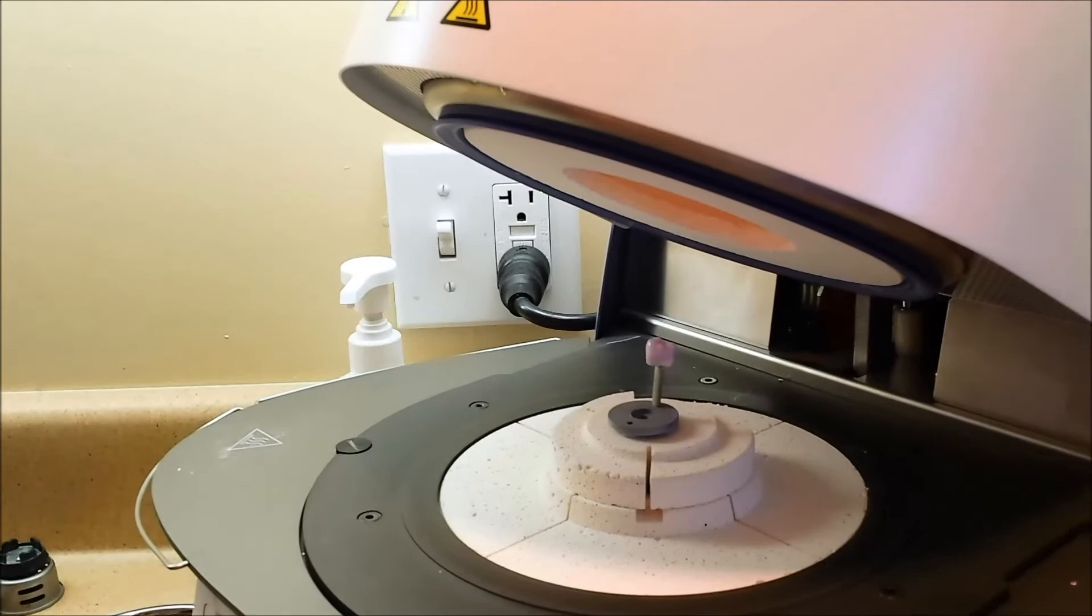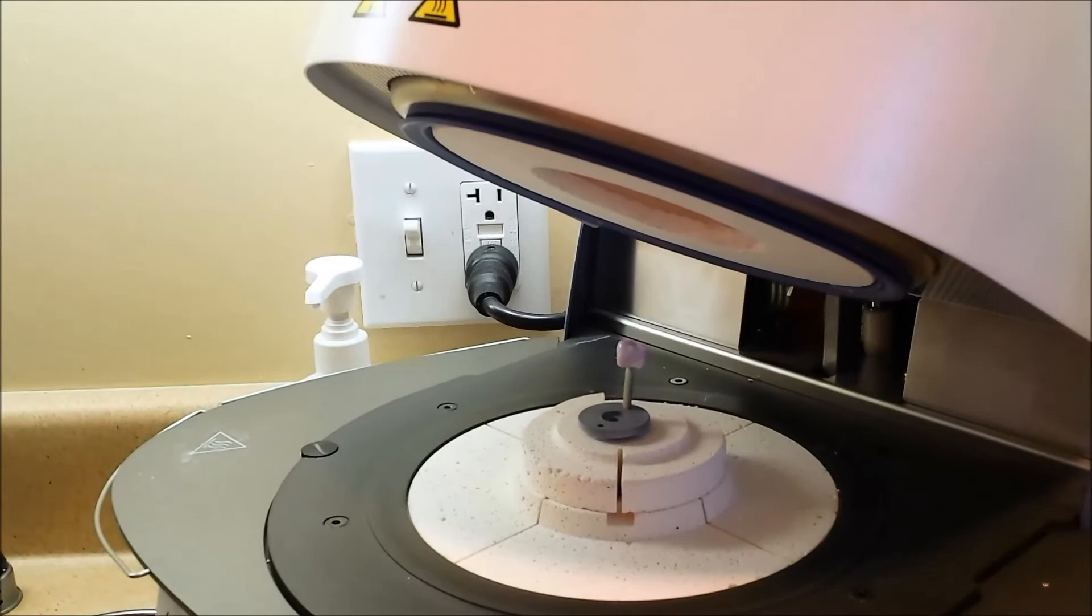And that is it. It's our in-office crown. So the worst and longest part was the drill.